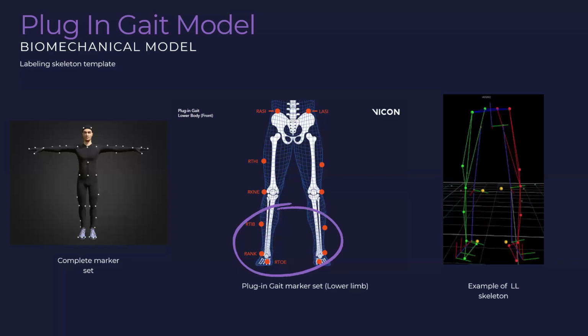The other thing about the treadmill, so you have a model. I'm curious, I never did this. You have the treadmill and the Vicon system with the biomechanical model of the gait. So you're doing an in-place movement. Does this translate into over-the-ground movement?